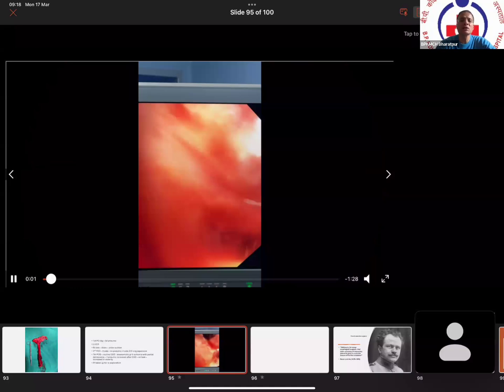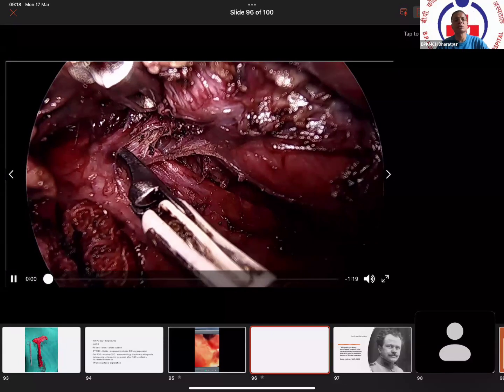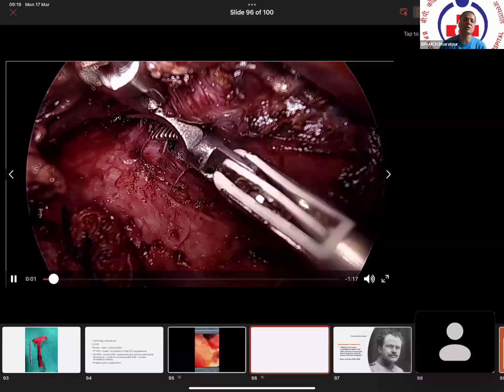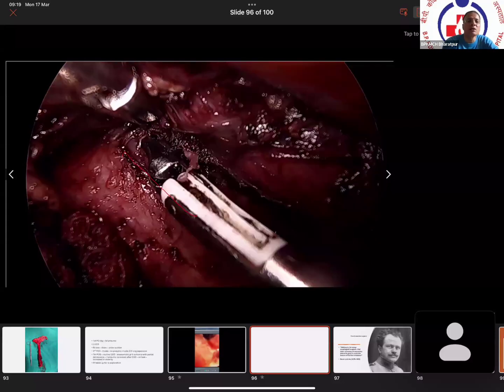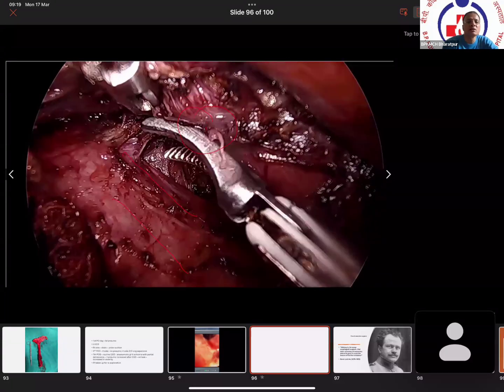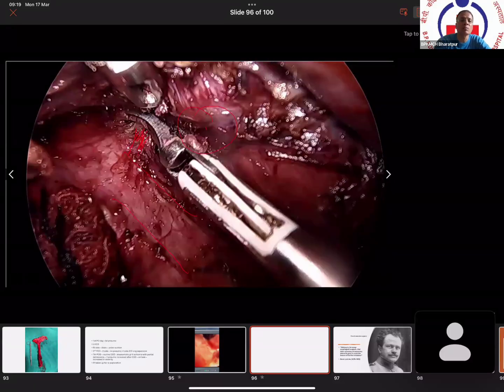After that, I went through the video of his surgery, which we had done 7 days ago. This is the video of the same patient. I reviewed it because this injury had happened during the surgery, which we did not realize. So now our whole team reviewed this video. At one point, there was dense adhesion with the left main bronchus. The tumor is here. There are dense cross adhesions here with the left main bronchus. I was using the bipolar cautery.